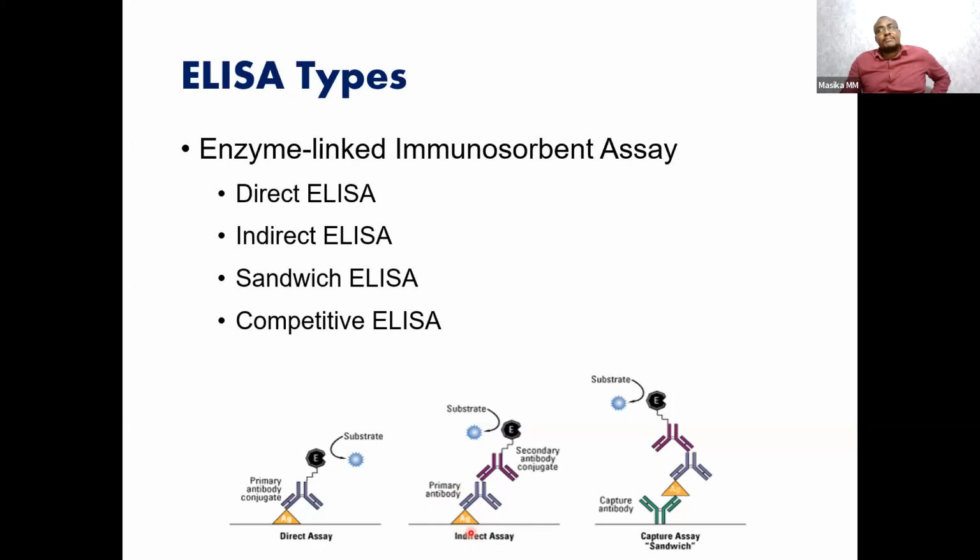Of course, the blood sample will have other antibodies, but those antibodies will not bind to this antigen because this antigen is specific. And then you have the detection mechanism which uses a secondary antibody. This secondary antibody will bind to the primary antibody. What we usually do is get something like an anti-human IgG. Because you expect that the patient sample will have human IgG, which binds to the antigen you've placed in the plates, you want to see if any human IgG has been bound. And for you to detect human IgG, you need an anti-human IgG antibody.